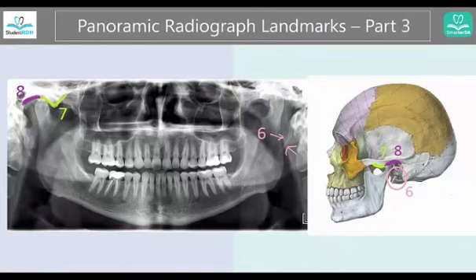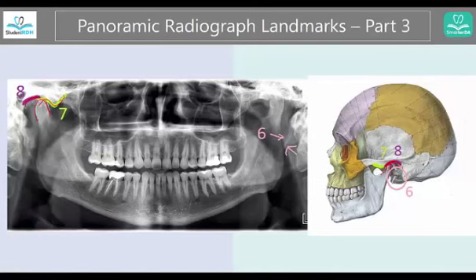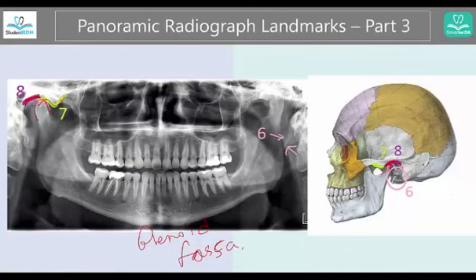Number eight. We've seen and located the condyle. Now we are looking at the area where the condyle fits into. It looks a little different because this panoramic image is a 2D of a 3D version, so it's a little expanded. But this area is called the glenoid fossa. Fossa is an area that is dipping, and the condyle would fit right into it. This is where you have the disc, and together it forms the TMJ.